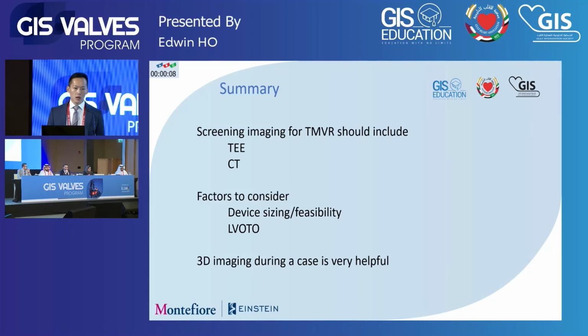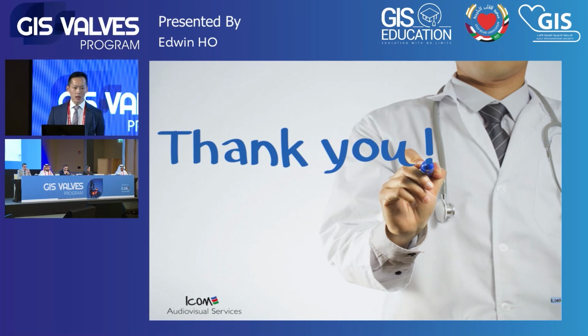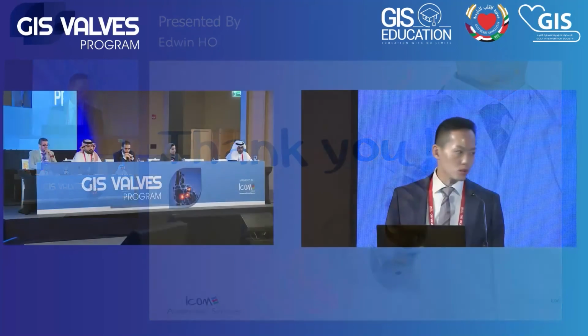So in summary, through this case, hopefully we've been able to discuss a little bit about some of the imaging around TMVRs, in particular the screening. So ideally, really a good TEE and a contrast CT, and then some of the aspects of intraprocedural imaging as well.